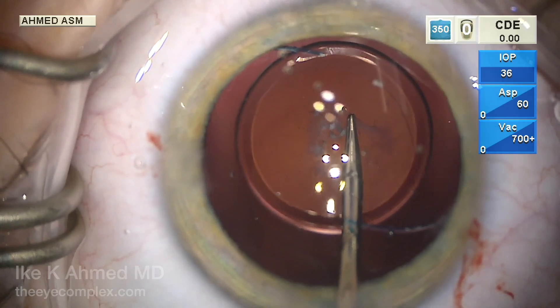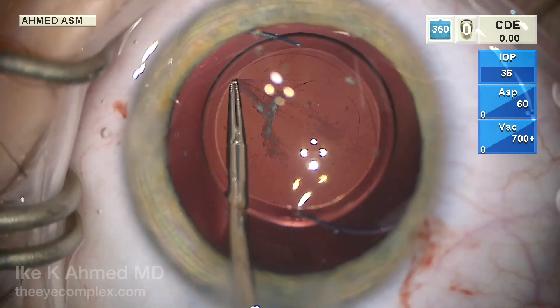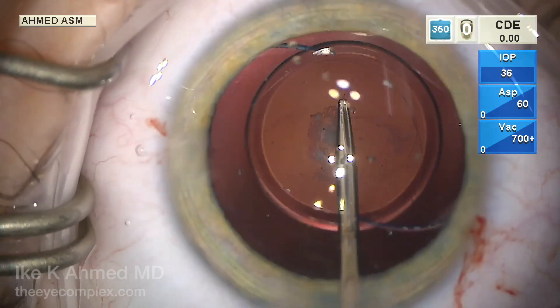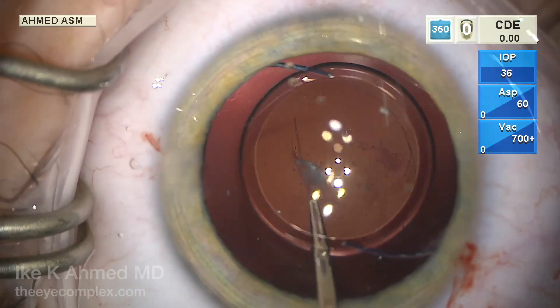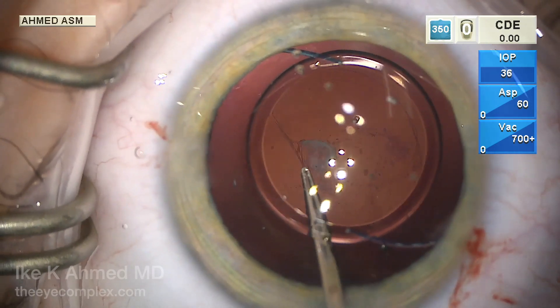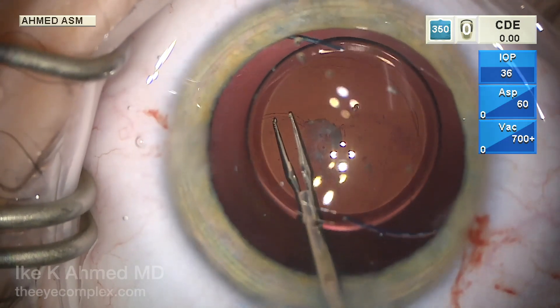We're using a micro forcep here to propagate the capsular rexis. This is basically like an anterior capsular rexis but it's thinner and harder to control, so frequent re-grasping is important. We have to make sure that this capsular rexis is no greater than the optic — preferably about five millimeters or so — to ensure we get good optic capture.